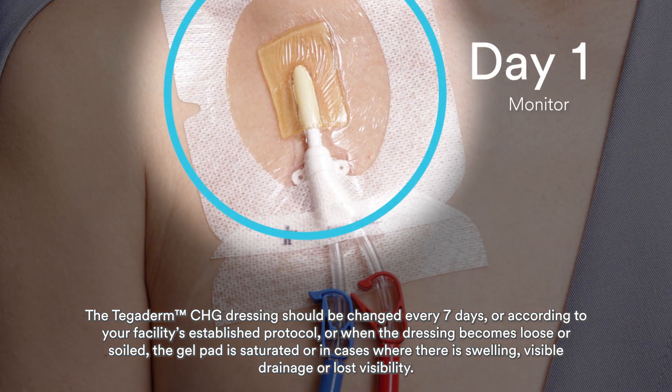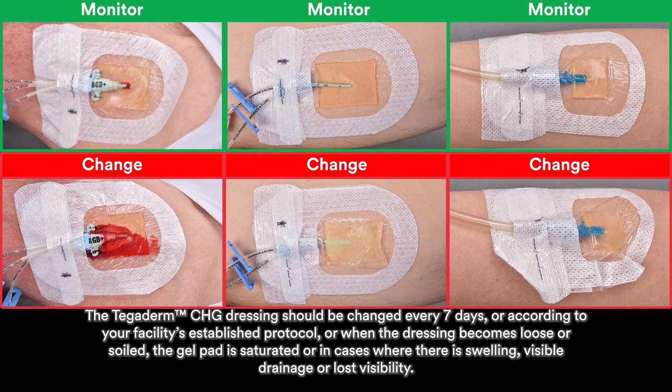The Tegaderm CHG dressing should be changed every 7 days, or according to your facility's established protocol, or when the dressing becomes loose or soiled, the gel pad is saturated, or in cases where there is swelling, visible drainage, or lost visibility.